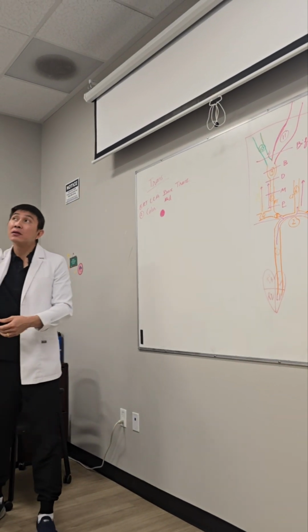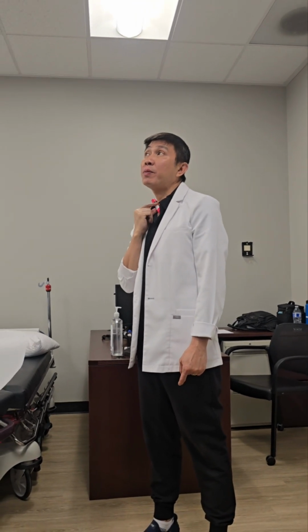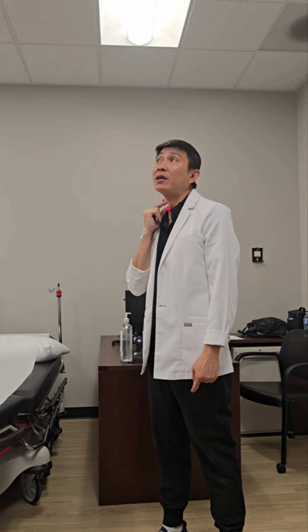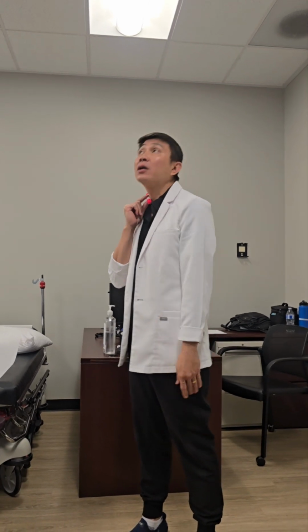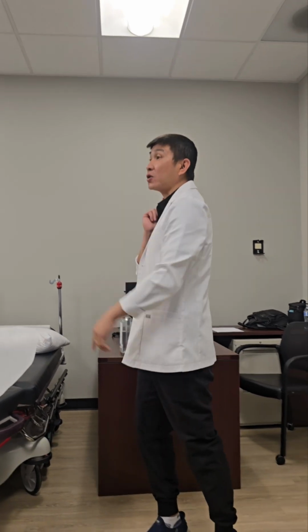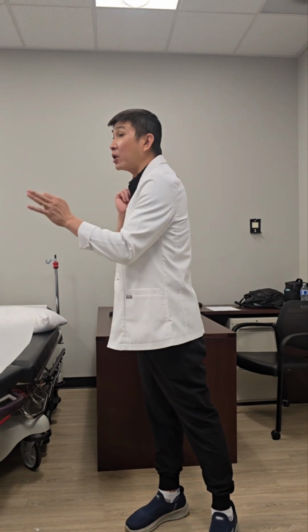It's going to look the same. We start transverse from the neck base for the proximal, and then we sweep up to the mid neck for the mid. Some hospitals skip the mid, but I want you to do it completely because you learn it. And then for the distal, you define it just like the way you define the distal of aorta: the distal has to be before the bulb.